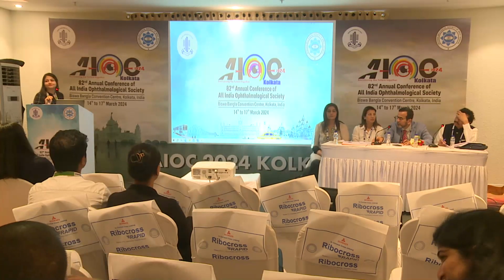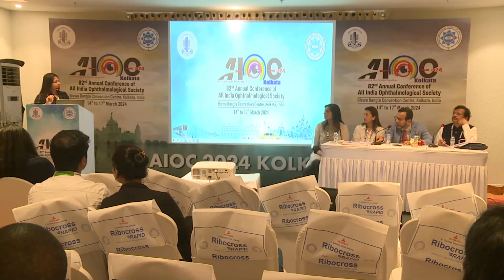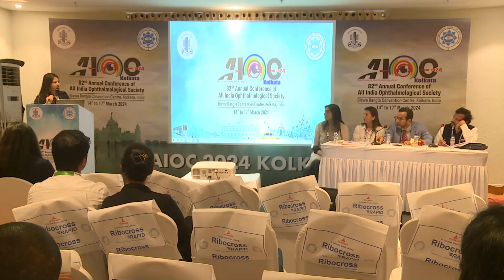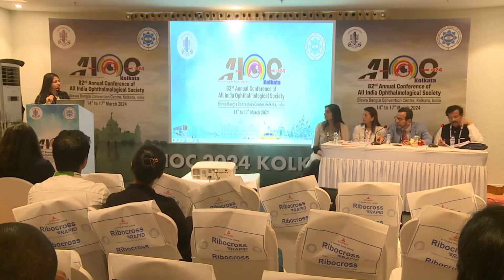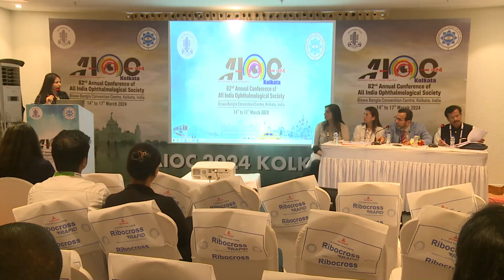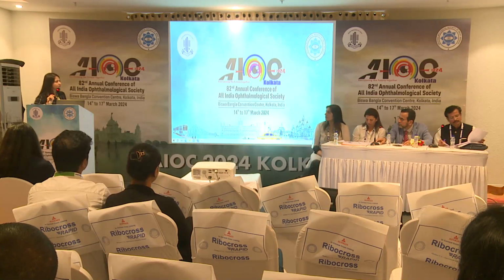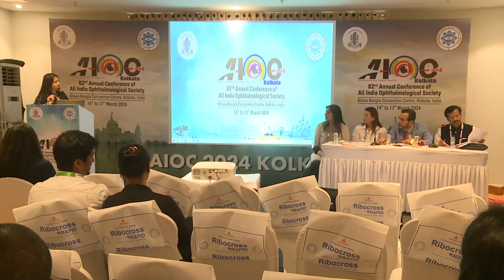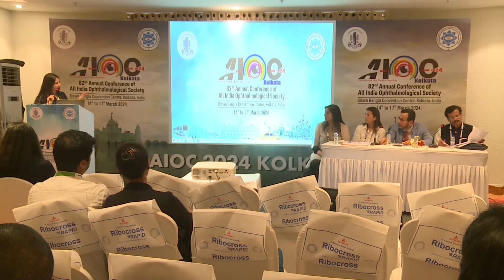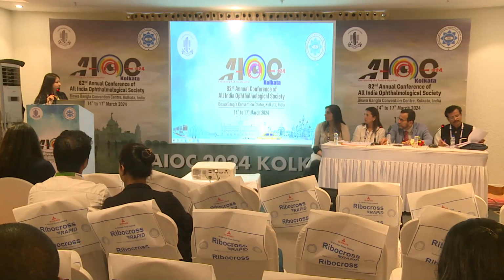Your post-operative hypotensive treatment in both the groups was the same? What is your post-operative hypotensive treatment? Timolol 0.5%, but if it is not controlled with one drug beyond 1 week or 10 days, then we would add another. Even in the hydro group, you were giving timolol? Same, sir. Same. Because there is no protective effect of the OVD which is present in the OVD group. If we use OVD, it will protect the endothelial cells.